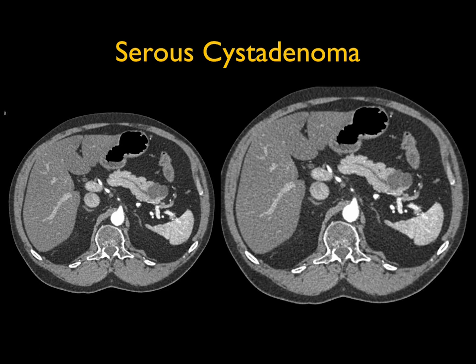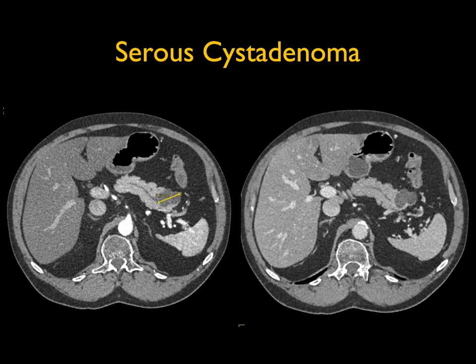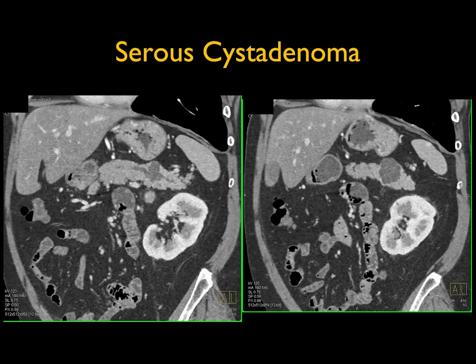Case five: a cystic lesion in the tail of the pancreas with a mildly dilated pancreatic duct. Could it be an IPMN? Could it be a mucinous cystic neoplasm (MCN)? MCNs usually have no dilated duct — a dilated duct pushes you more toward IPMN. This lesion is somewhat cystic with thin septations, about three centimeters. On coronal view, when I see thin septations I'm thinking MCN, particularly in a 40-ish-year-old female in this location.